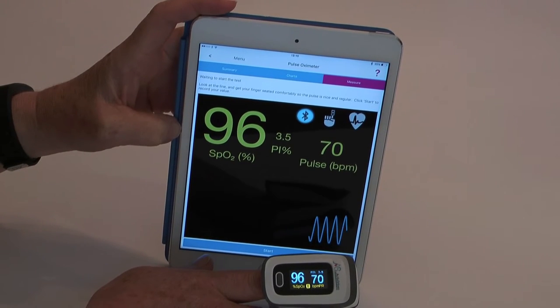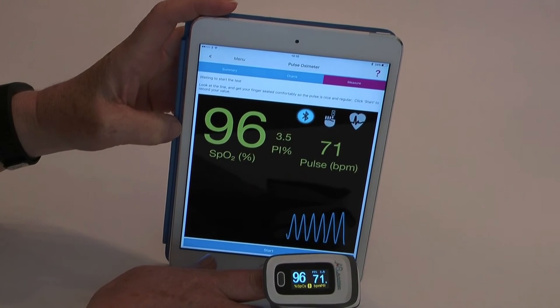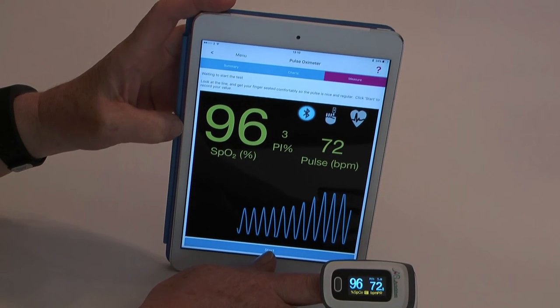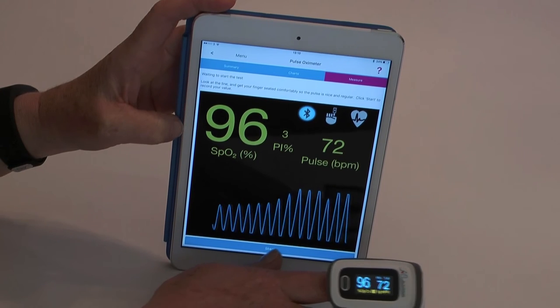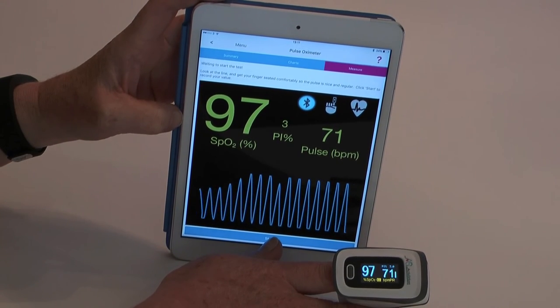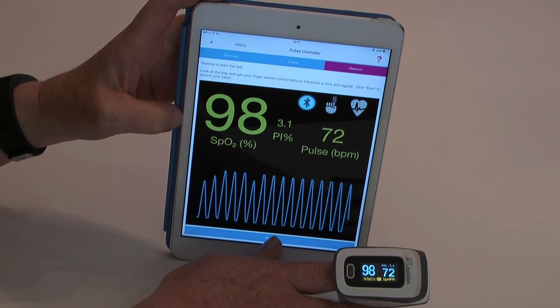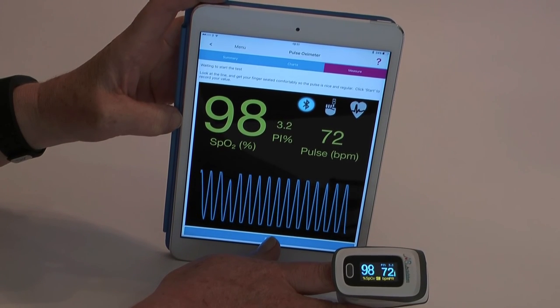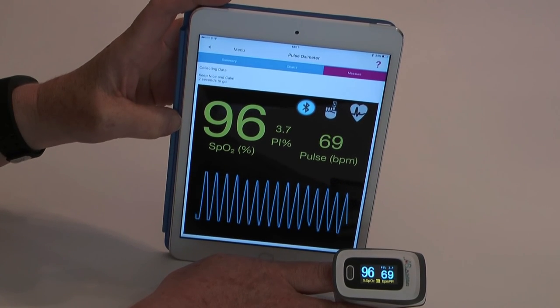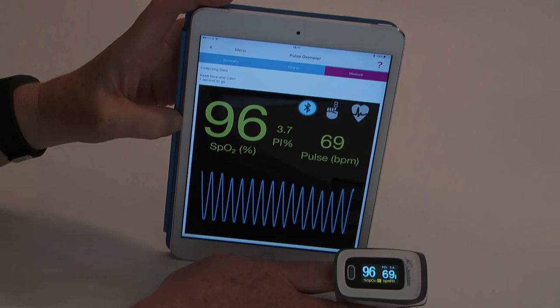When the pleth trace in blue becomes even, then press start in the blue banner at the bottom and it will take your reading over the course of several seconds. The reading on the left in larger numbers is the blood oxygen saturation percentage, and the figure over to the right is your pulse rate.